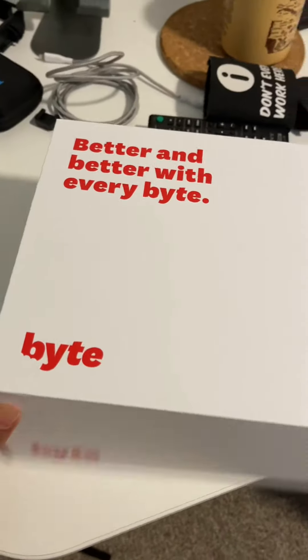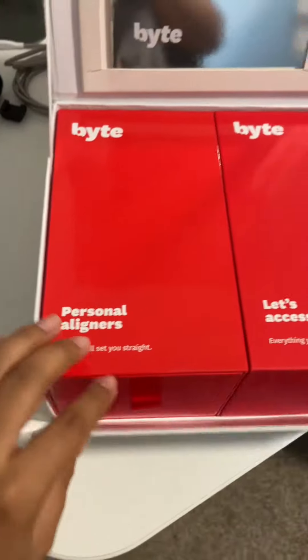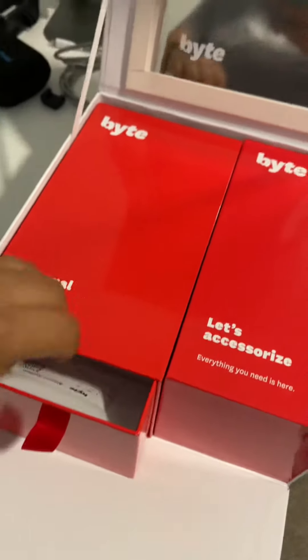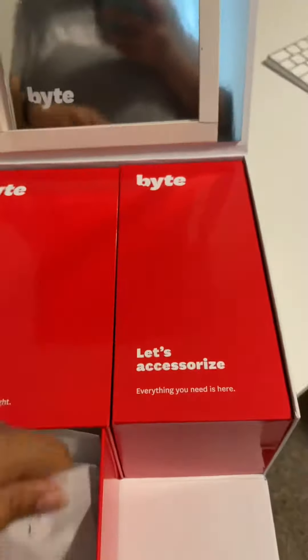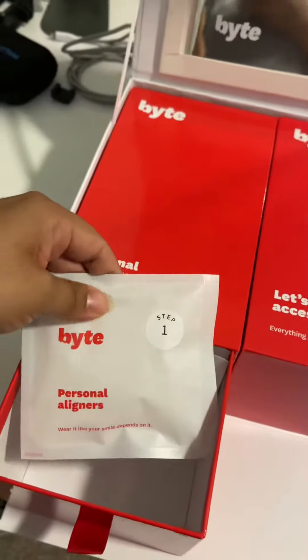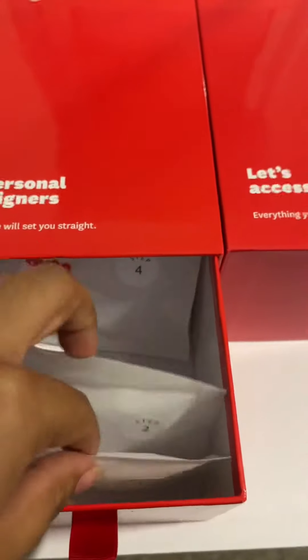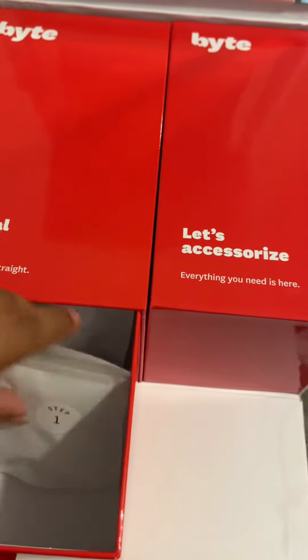My liners came in — this is the box they come in. You open it up and it kind of flaps open like a cool little drawer. Here's step one, and we will put these on tonight. They're all labeled step one, step two, step three. My bottom is going to be a lot shorter.